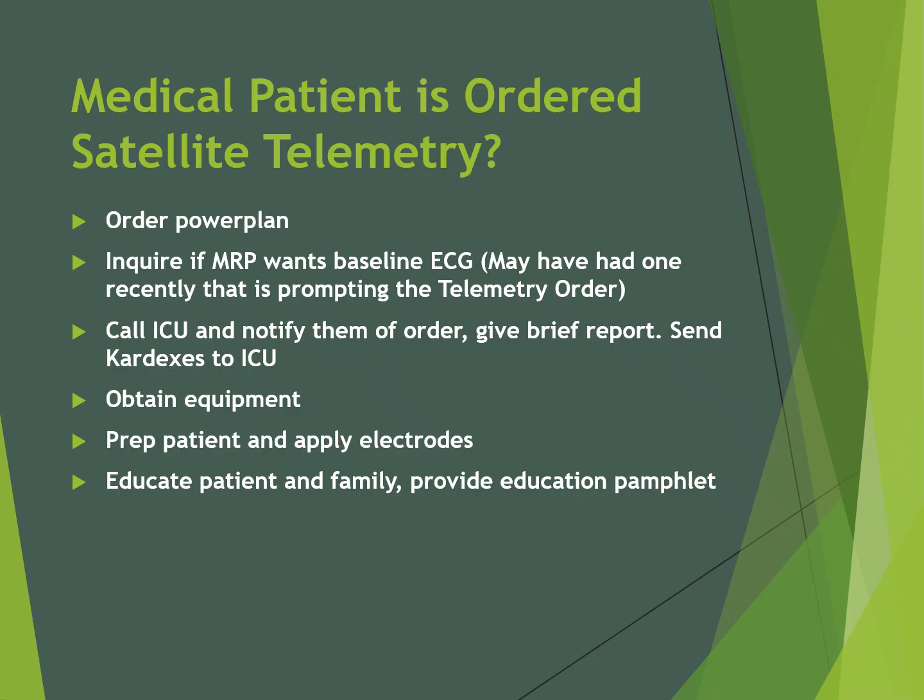The medical staff will call ICU and notify them of the order and give a brief report, sending the cardexes to ICU. Equipment will be obtained, the patient prepped and electrodes applied, and then the patient and family will receive education, including the education pamphlet.